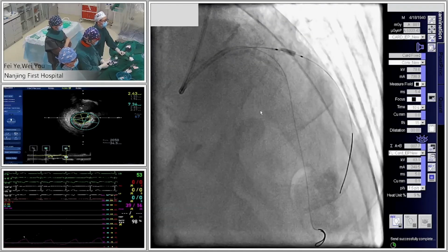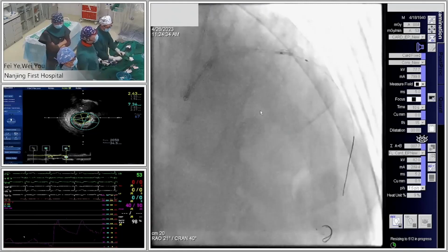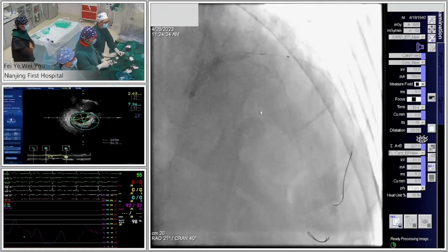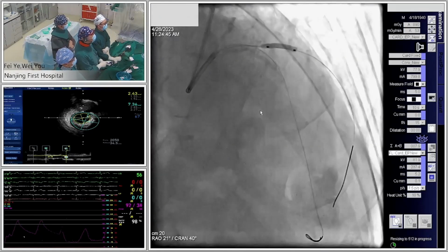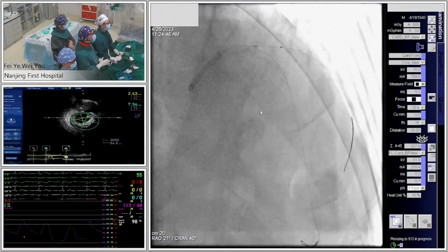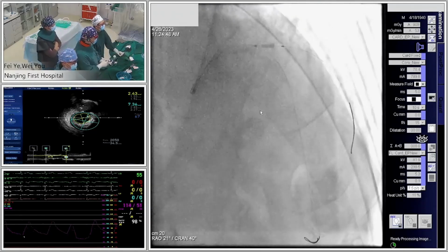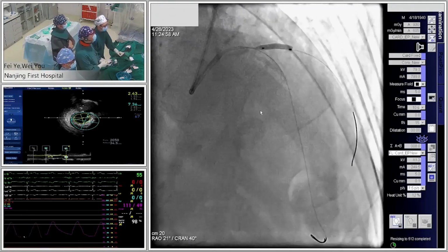12. If we find this phenomenon cannot be avoided, we can use a cutting balloon or scoring balloon to prepare the lesion. Inflate. 12. Okay, good. Expansion good. Pull the diagonal wire a little back, to distal. Inflate. Make sure there is low complication. 12, 14. Okay. Down.